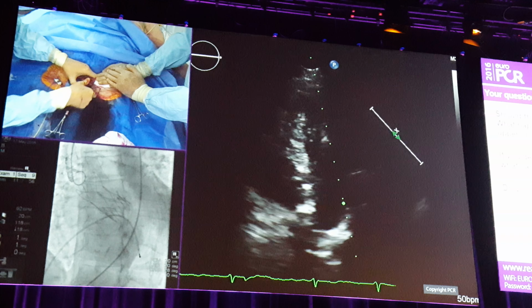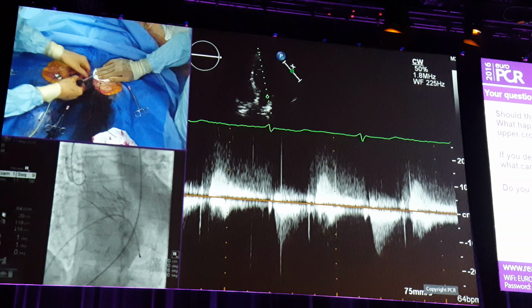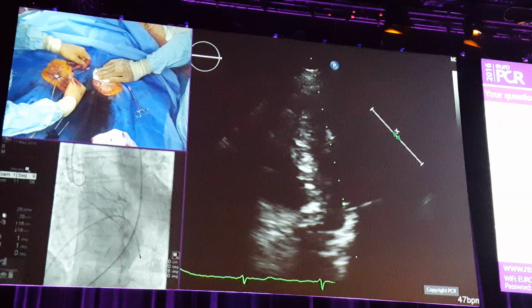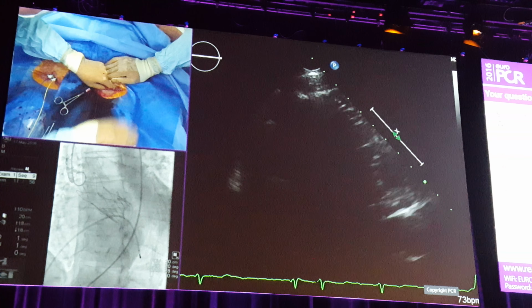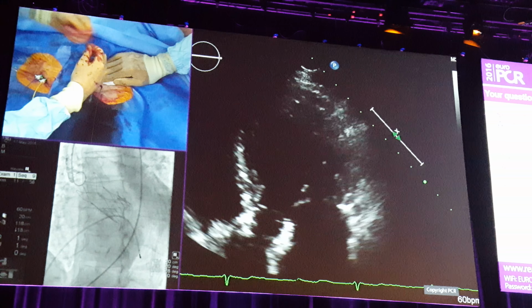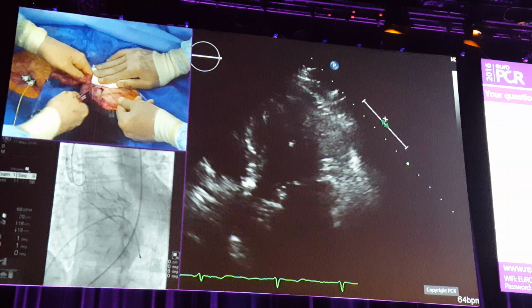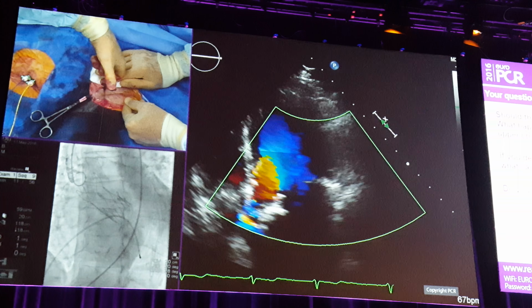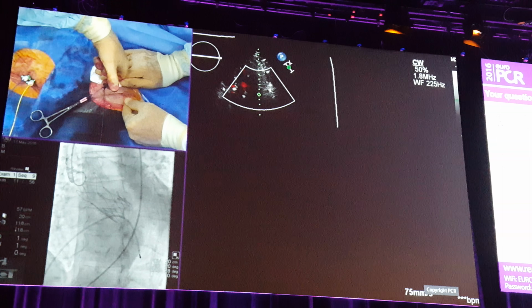Well, second question first. The first one, I guess, is I don't think there are any, but of course, if it's narrow, you probably use a smaller valve. But for the second question, if you've deployed the top crown and it's not in the right position, it depends if you think it's too high or too low. If it's too high, it's fairly easy to put some more forward pressure on it to move it down a couple of millimeters. If it's too low and you're subannular, it can be very difficult to pull the device back across the annulus once the top crown has been deployed.